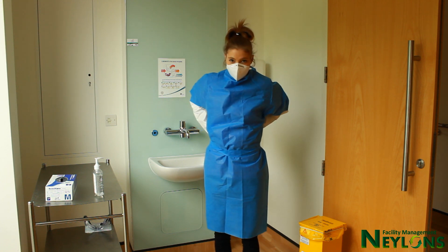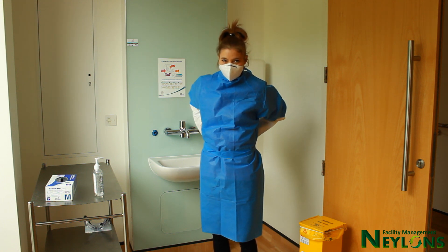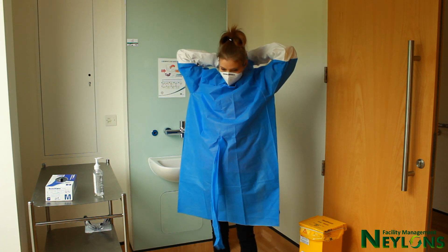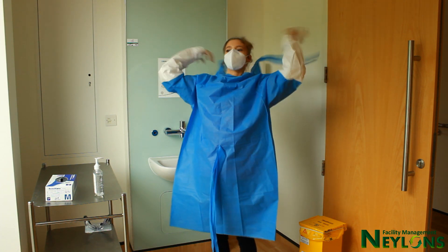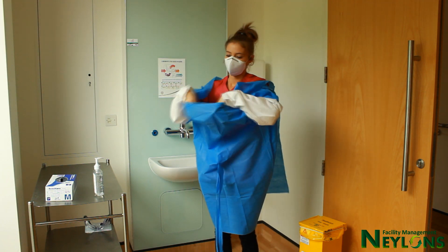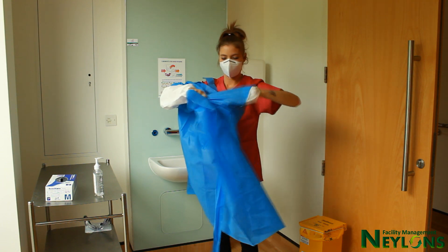Remove gloves and decontaminate hands again. Release the gown from the back — this is the least contaminated area. Without touching the front of the gown, push away from yourself.